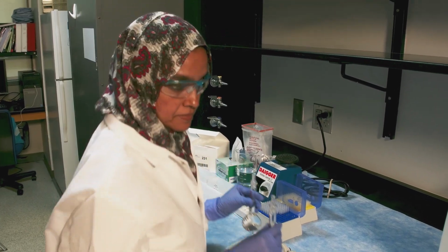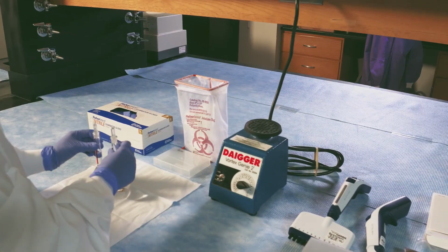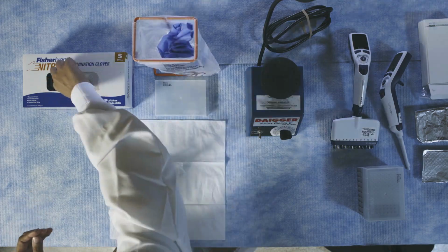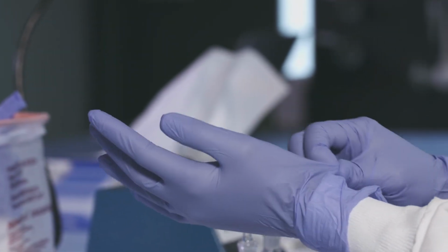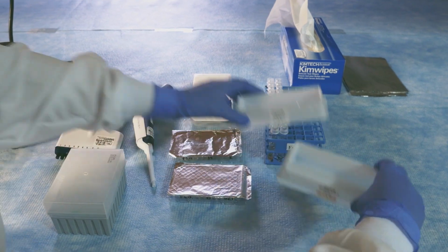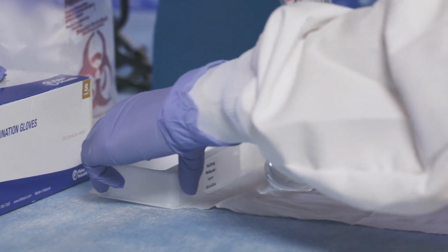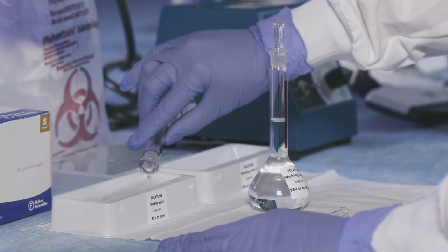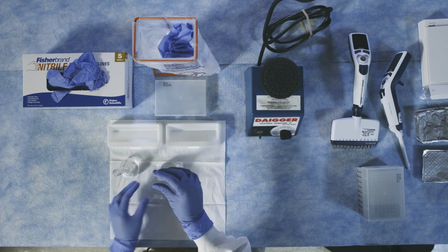Now you can move back to your sample preparation area. Change gloves to prevent accidental folate contamination. Pour the level 1 and level 2 working solutions into 2 labeled basins.